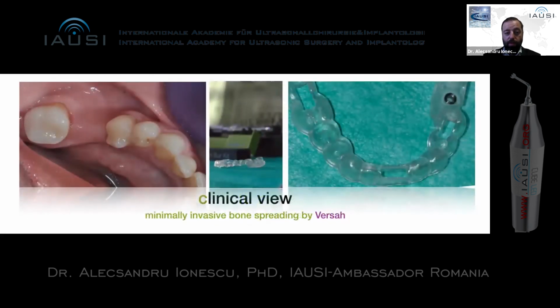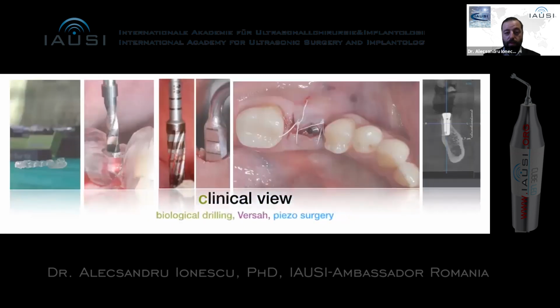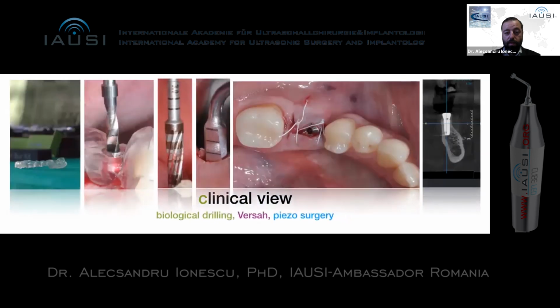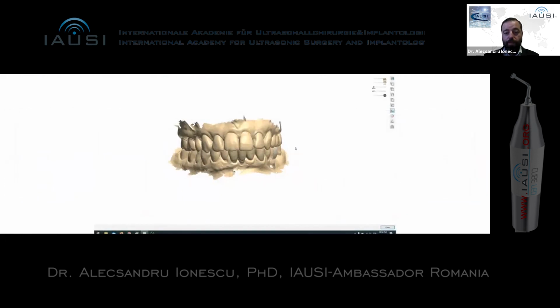And this is how it looks in the clinical aspect. And the armamentarium that we used with Piezotome surgery. And this you can see on the last page. You can see the bone, the buccal bone. And this is the case when we did the final prosthetics in a digital way as well.